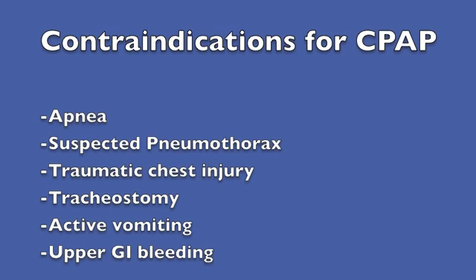The contraindications for CPAP use include apnea, suspected pneumothorax, traumatic chest injury, tracheostomy, active vomiting, and upper GI bleeding.